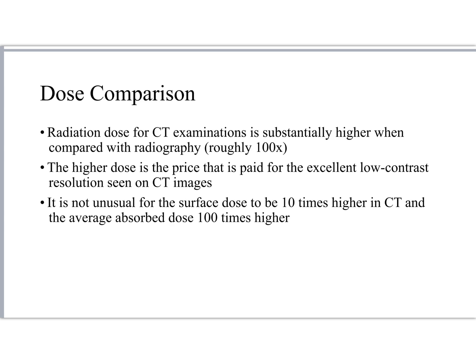So it's not unusual for the surface dose to be much higher in CT as well, and there's really not a lot that we can do to shield the patient, if we're completely honest, and this is a point of controversy, because we're spinning the X-ray tube around the patient. And in fact, shielding is kind of controversial in and of itself right now.